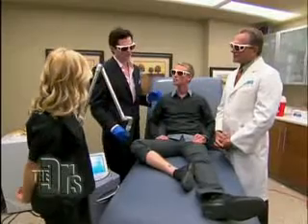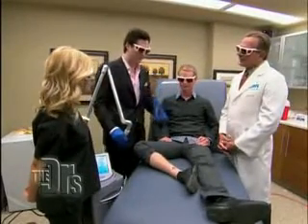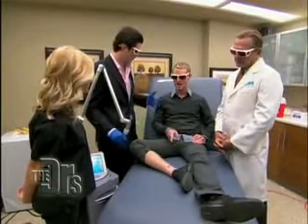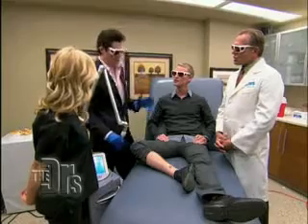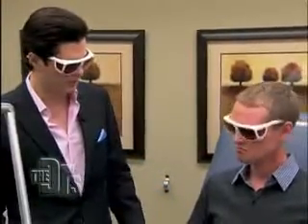Absolutely. It's a process called selective photothermolysis. I know you're thinking nerd alert. You're probably right. I'm a little nerdy, but it goes in and destroys a specific chromophore. And I'm really pleased with the result he's getting. How are you doing? You feel okay? How many treatments does this take typically? It takes multiple treatments to remove the ink completely. You'll need, in my approximation, approximately 7, and we want to space them about 6 weeks apart.